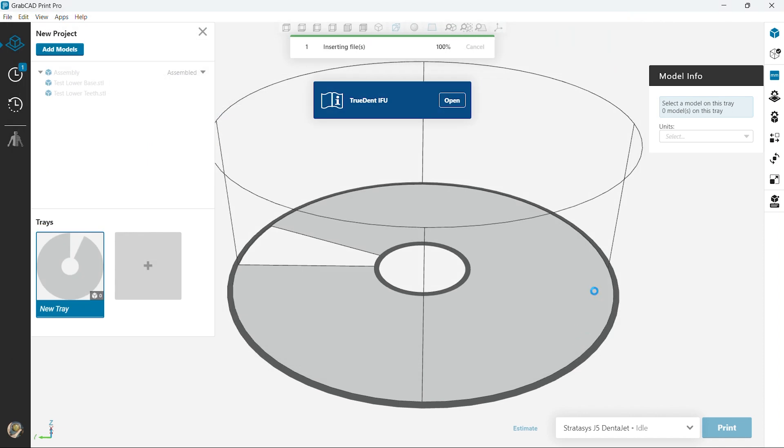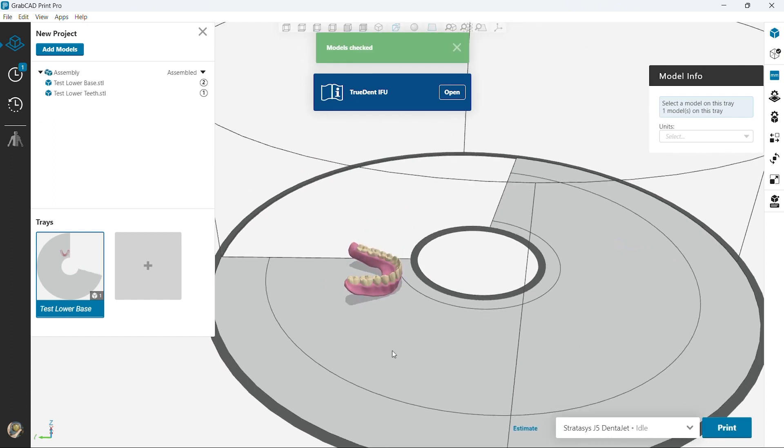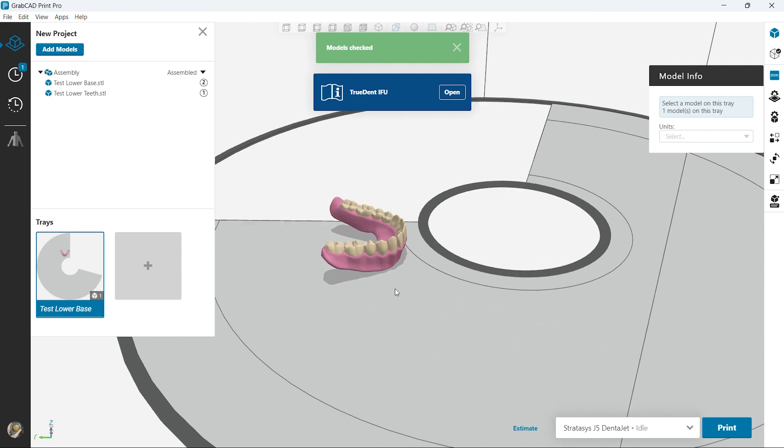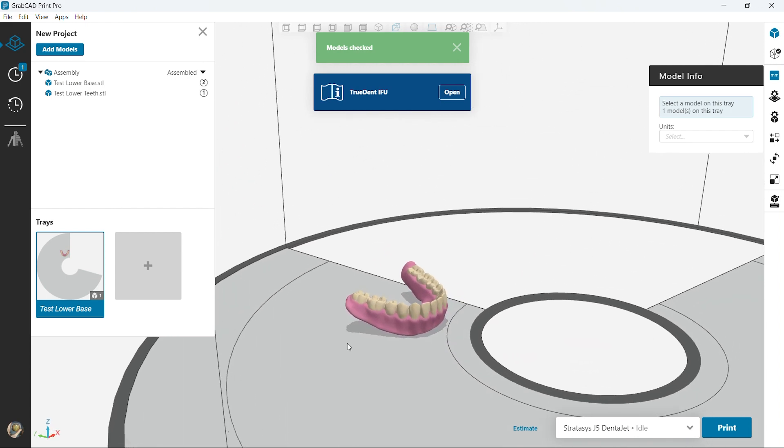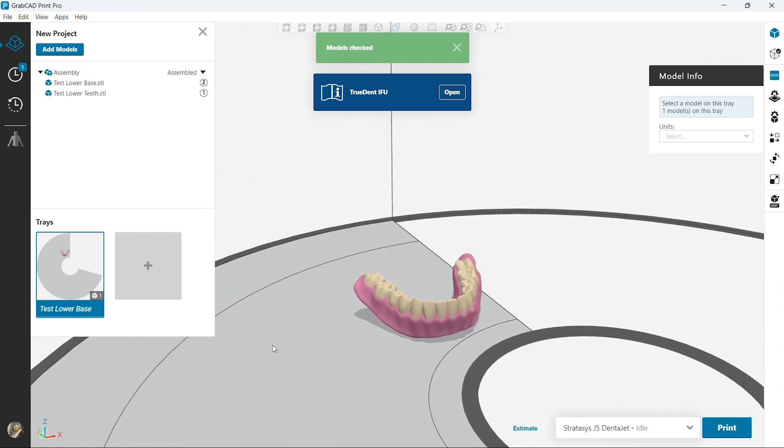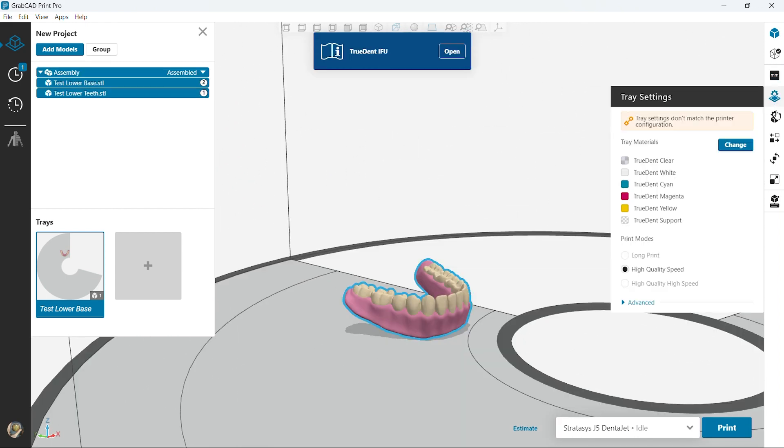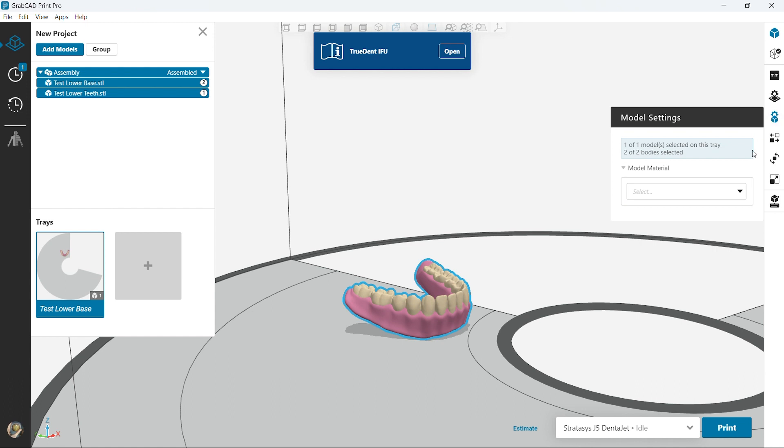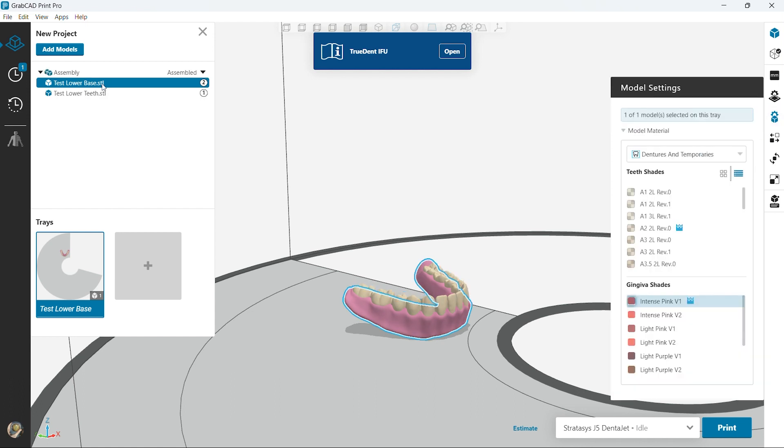It's going to bring it in as two separate bodies. It's going to identify the teeth and the base. So right here we have a pretty basic denture. It imports and automatically assumes a color, but we have the opportunity to change this.